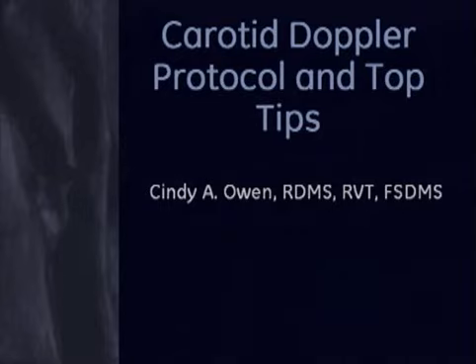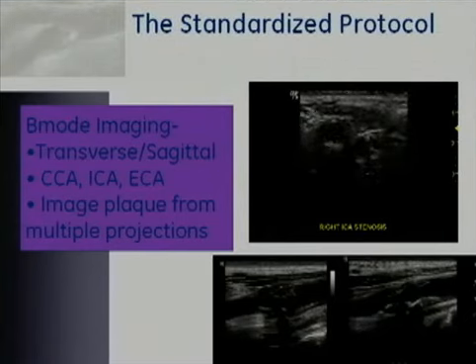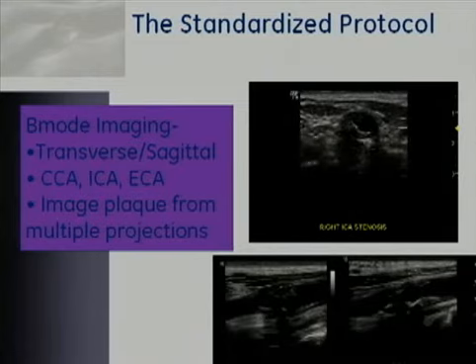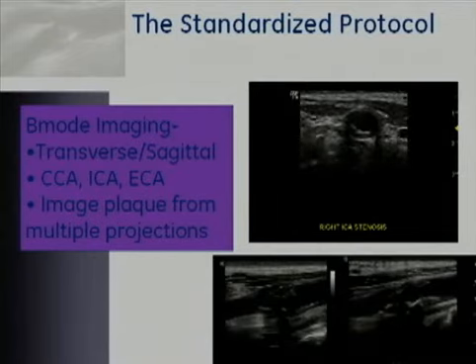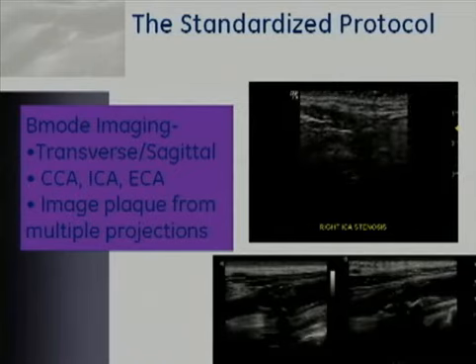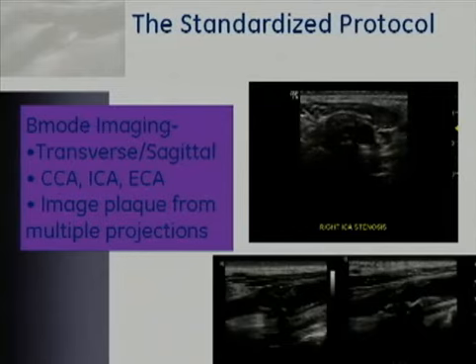I'm going to talk about carotid Doppler protocol and some tips for performing the exam. What I'm going to start with is the standardized protocol. That's very important that within each lab performing carotid Doppler that you have a protocol that is written down that can be followed by everyone in the laboratory. This will standardize the procedure and is very important for follow-up of patients.